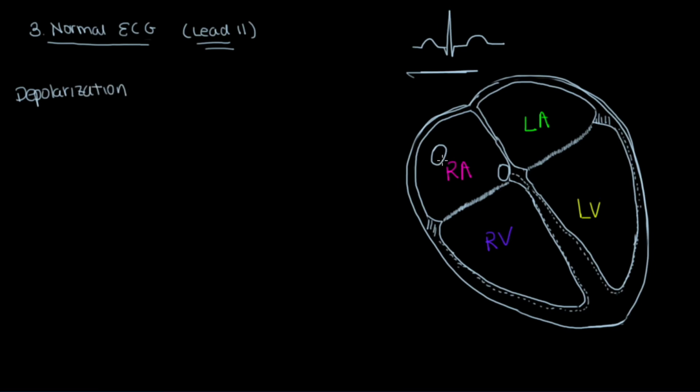Okay, so we're going to start here. Again, the pacemaker of the heart, the SA node. So now you see here, the charge goes off and the depolarization propagates all throughout the right atrium, right? So what that would look like just for the right atrium is kind of like this. And it stops right here at the AV node, right? And as the right atrium is depolarizing, remember this is not insulation, this is just a border between the right atrium and left atrium. There's no insulation there.